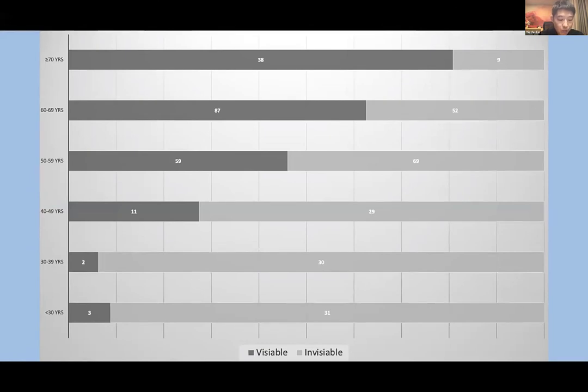We could observe the sensitivity of ophthalmic imaging for vitreous floater in different age groups from this figure. The sensitivity becomes higher along with aging. Previous studies have demonstrated that as one ages, vitreous liquefaction worsens and the vitreous collagen changes.